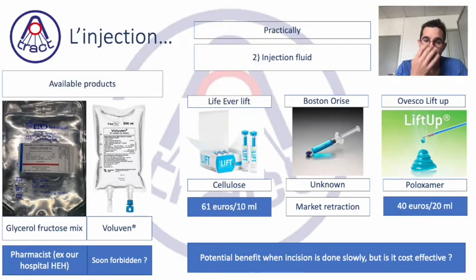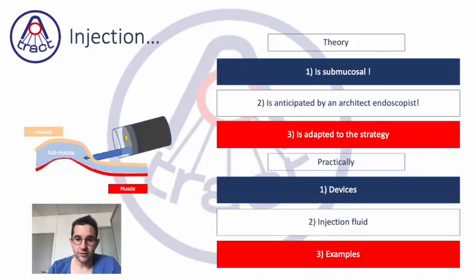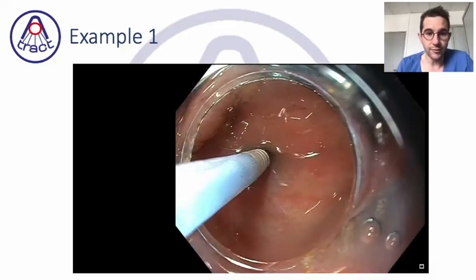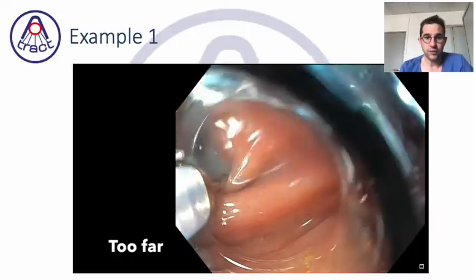because of problems of scarring with a kind of eye reaction with hyperplastic areas on the area of the resection, it has been removed from the market. So all these products probably have a benefit, but is it cost effective? We don't know exactly.